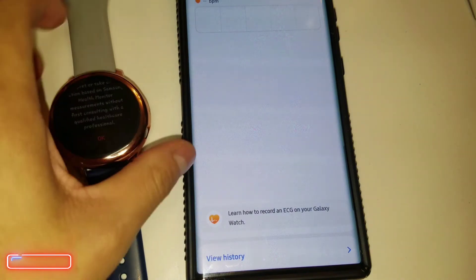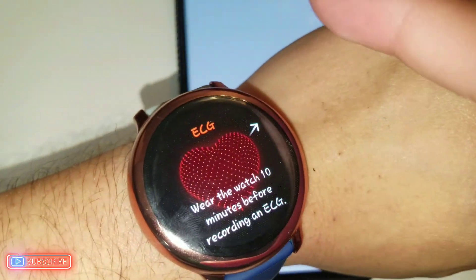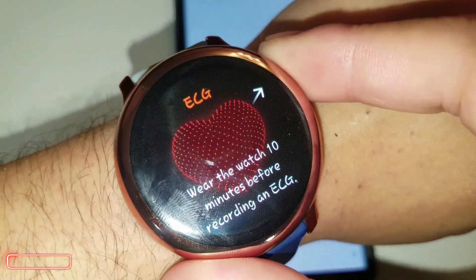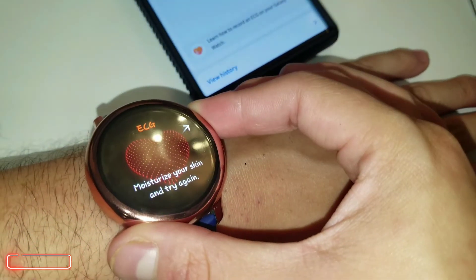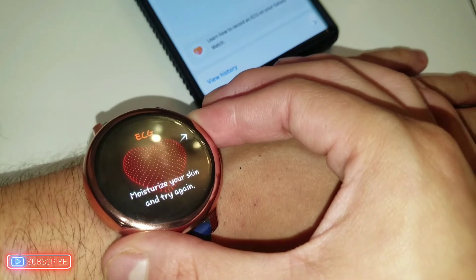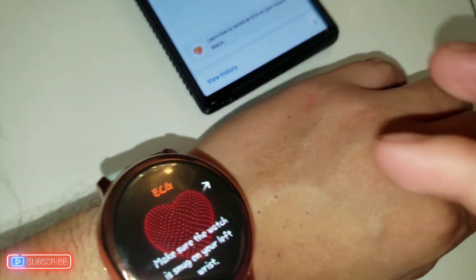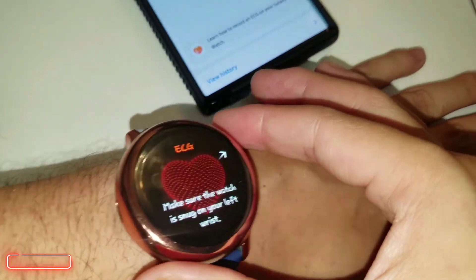Let me go ahead and put my watch on. I'm going to place my finger on the button and rest. It says 'Moisturize your skin and try it again' — so that's what we're going to do. Let's try this again.